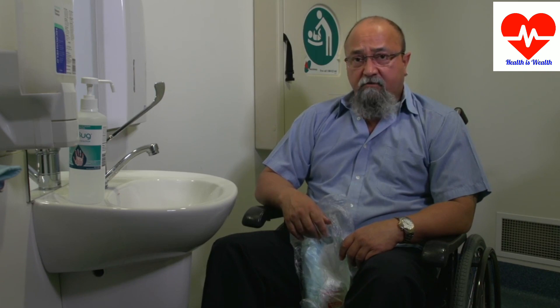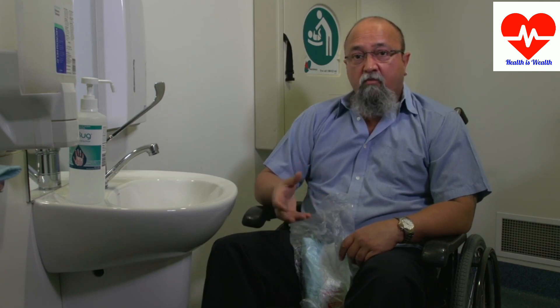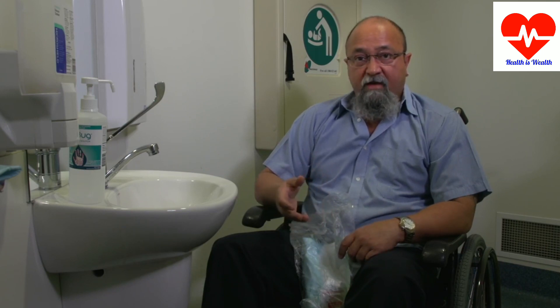Now I'm going to get my gear out and set it up. You will set it up in your own way to suit yourself, but before I start I'm going to wash my hands.